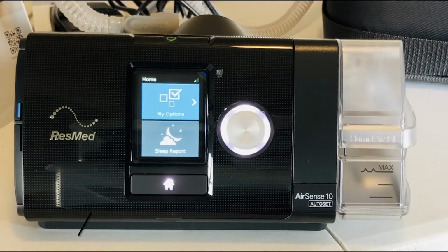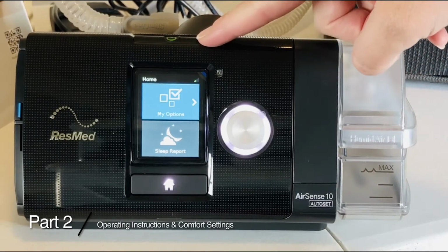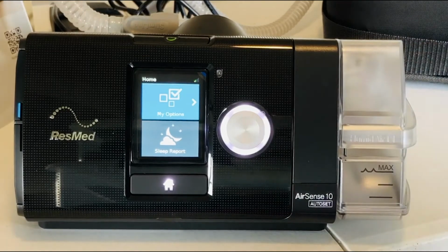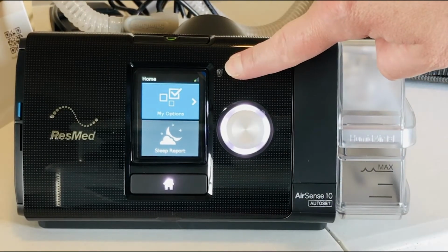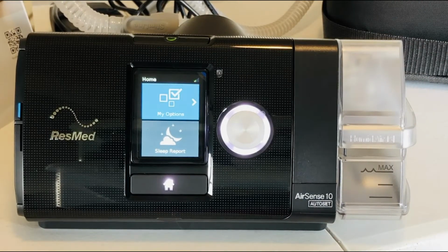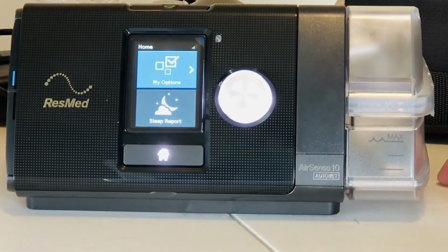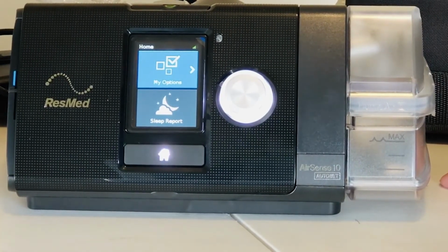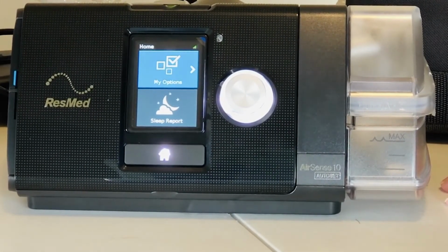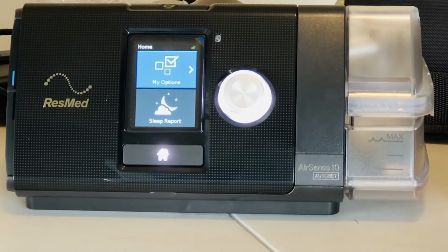The ResMed AirSense10 only has 3 buttons: the start-stop button, the silver dial, and the home button. There is a light sensor located right here, so the screen may appear brighter or dimmer depending on how much light is in the room. The light is designed to go off with sleep to keep people who are light sensitive from being kept awake. Your CPAP machine will be set to the correct pressure by your provider as ordered by your physician. You, though, can change some comfort settings.